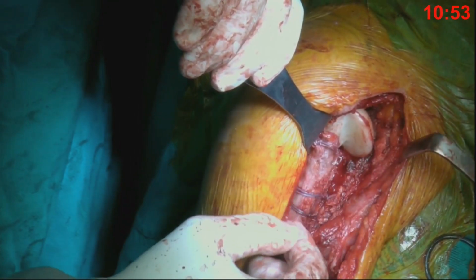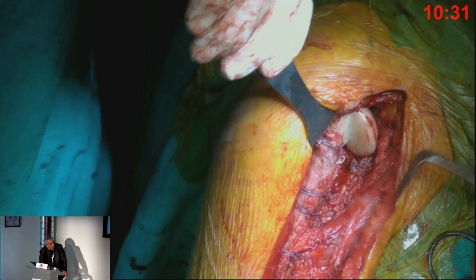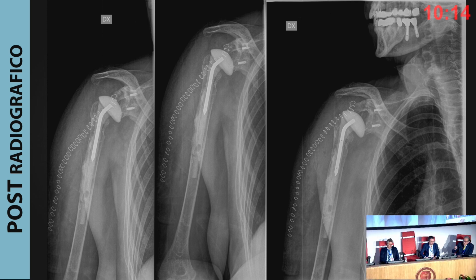Regarding the spacer, also in the literature, we are very precise when we speak about the anatomic prosthesis stem and the reverse prosthesis stem regarding the position. What is the position of this kind of tool? Do you want it high, low, or centered with the glenoid? Is there some rationale behind the positioning of the spacer, or do you put the spacer as it happens, or do you follow some rule? Maybe the most important thing is the version. You can see dynamically when you finish the position if you are happy with 20-30 degrees of retroversion, and see as you feel that it is stable.